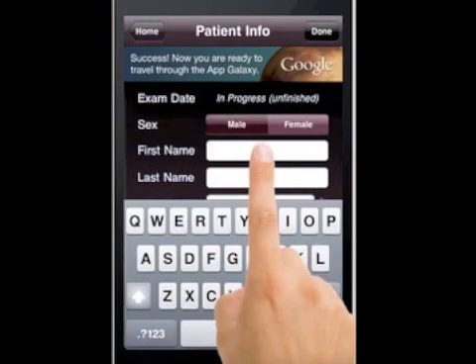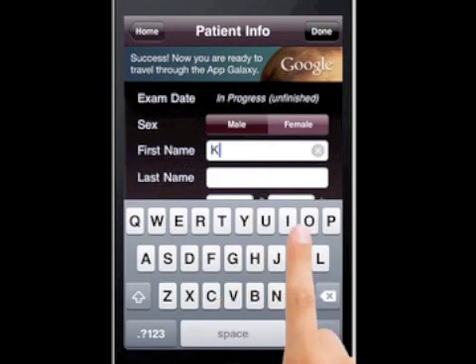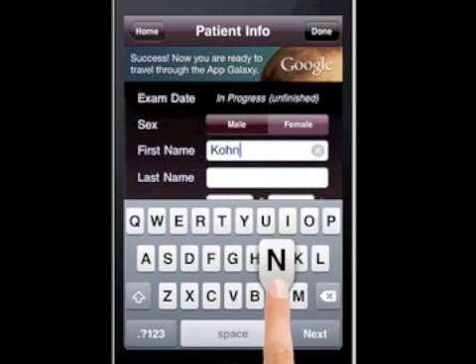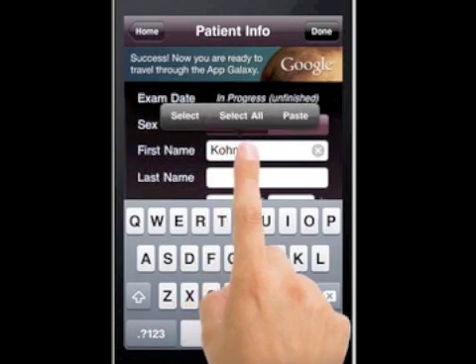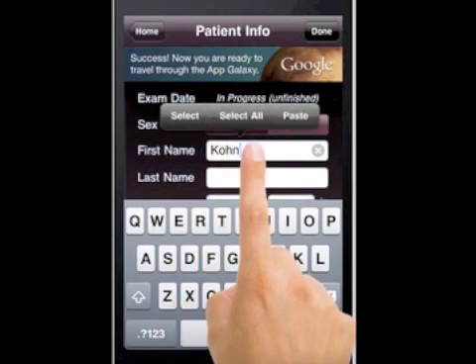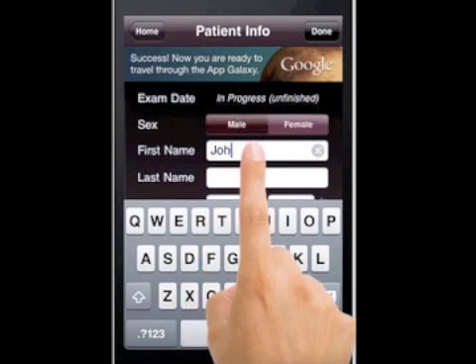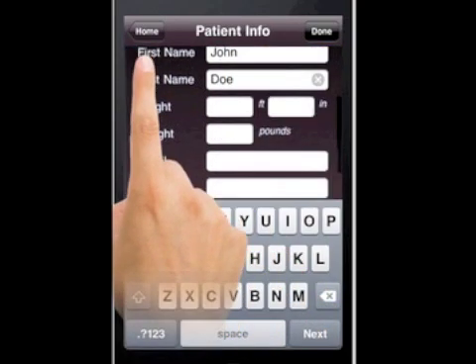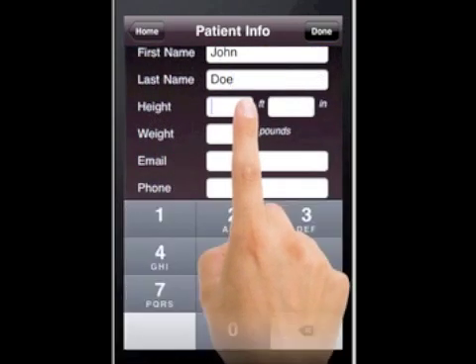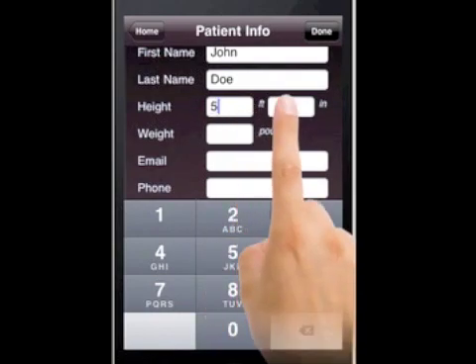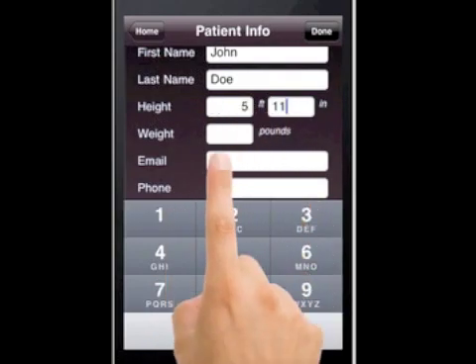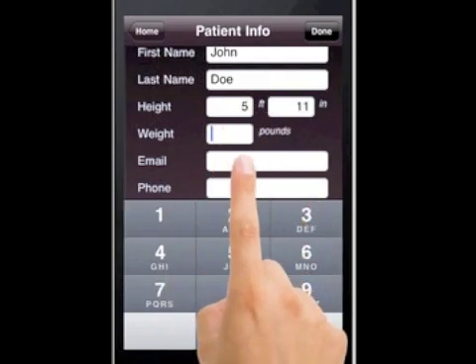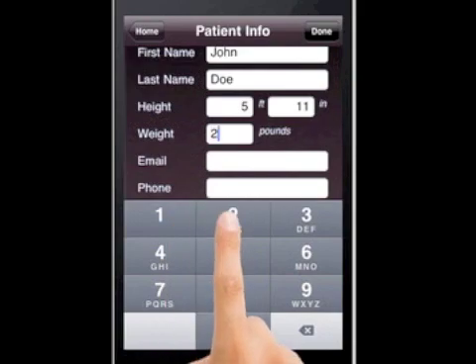You're going to go ahead and put in their first name. I'm going to put their name is John — John and Doe. Then we're going to slide this up and put in their height. We're going to say they're 5'11" and their body weight is 220.